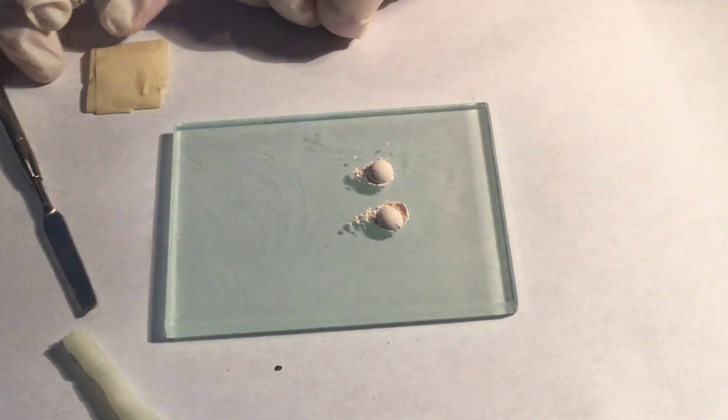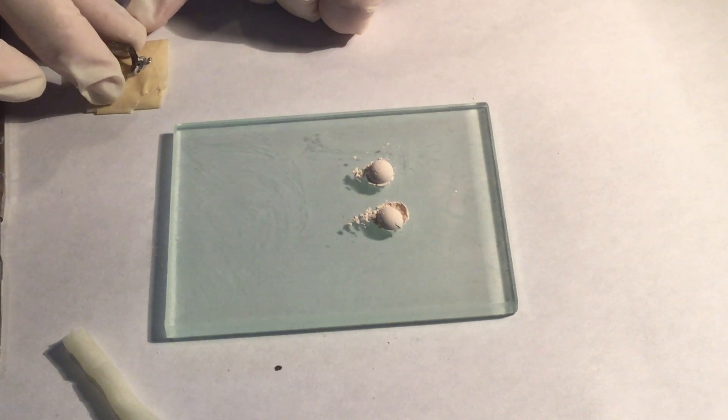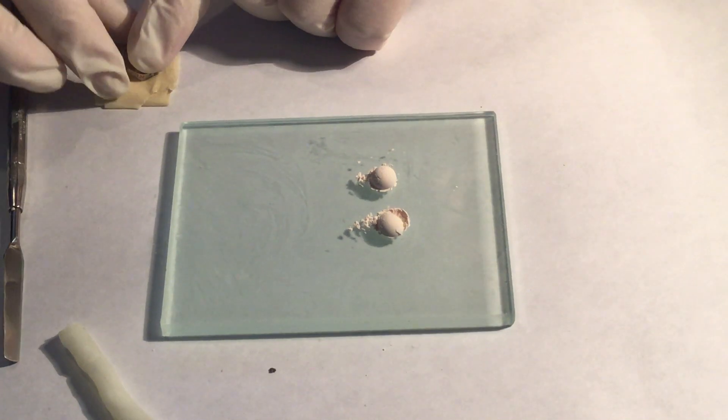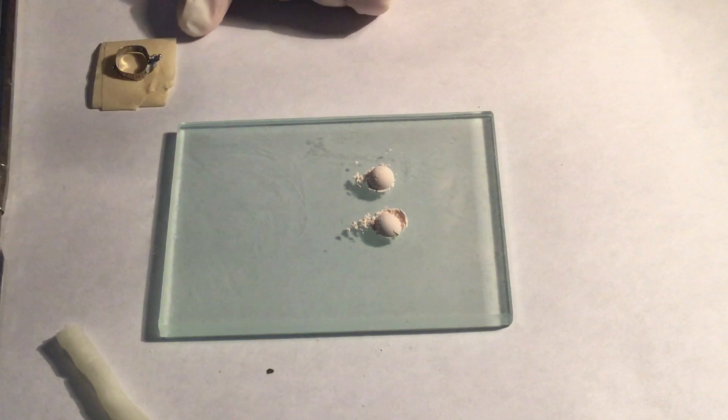If you're using tape to help place the band on the tooth, make sure that you place the band with the ball hook facing up.